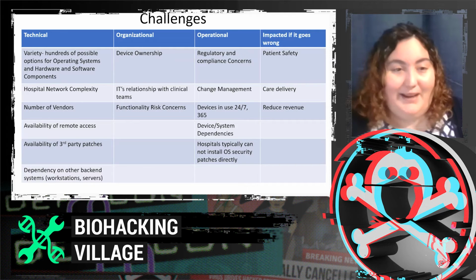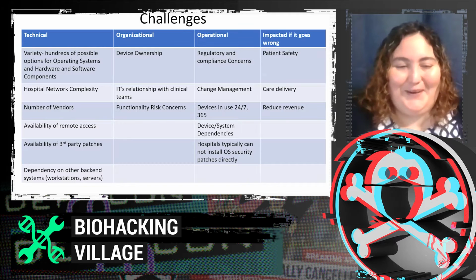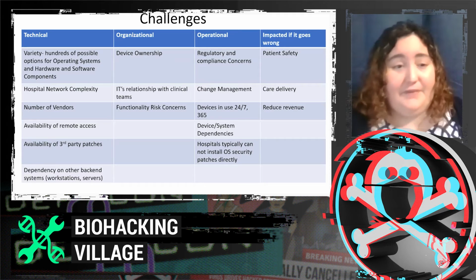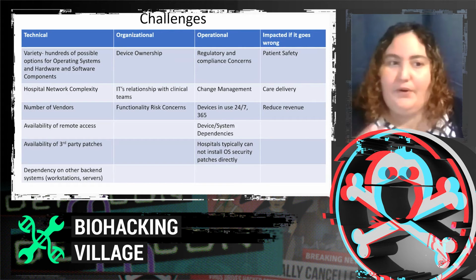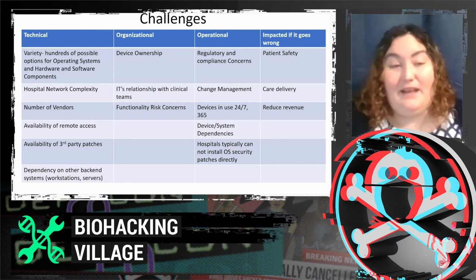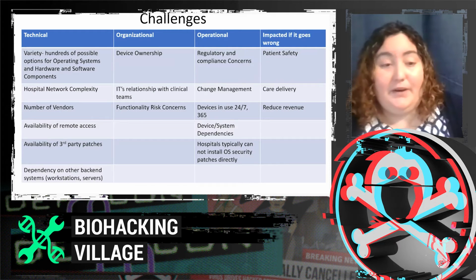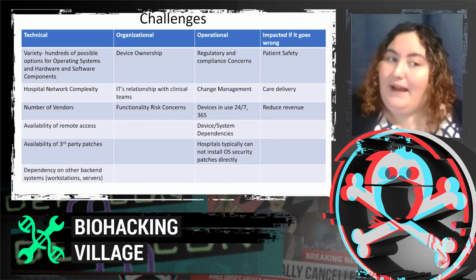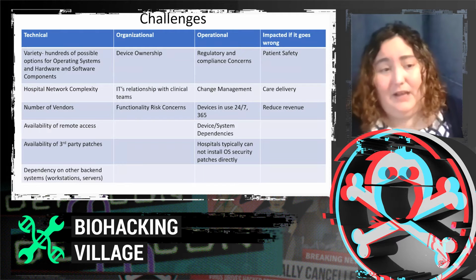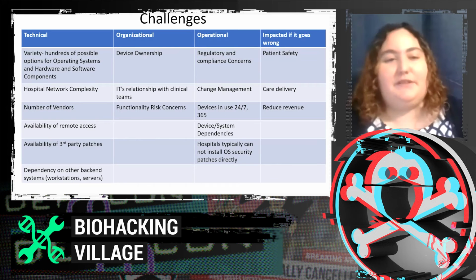The hospital network has some complexity and risks. You have a lot of vendors. You know, we like to think you only use us, but that's just not the case. There is a number of vendors. There's a number of platforms for remote access, and some devices do not have remote access available at all. Then there's the availability of a third-party patch. Just because a third-party component has a risk does not always mean that they will get us the patch in a timely manner to provide it to you. And then there's dependencies on the back end, servers and the like.